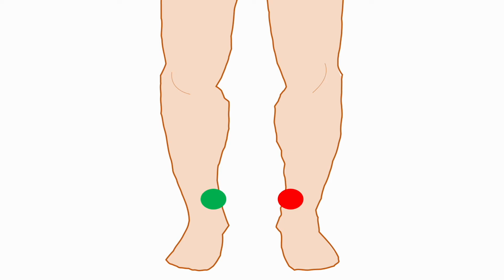Leads should not be placed directly on a bony structure like the ankle. Placing arm leads on the wrist can be easy and provide a good picture, but be cautious as patients tend to move their hands a lot. This can cause artifact in the EKG reading.